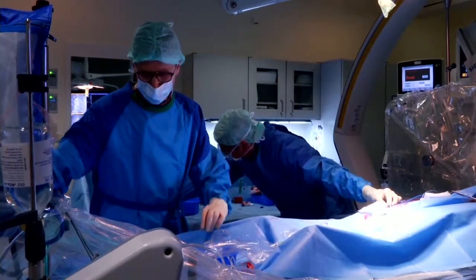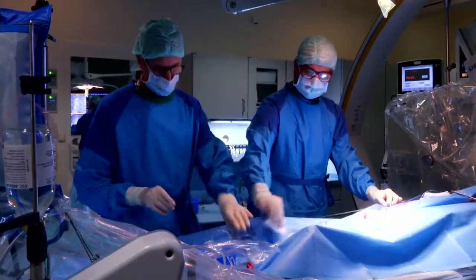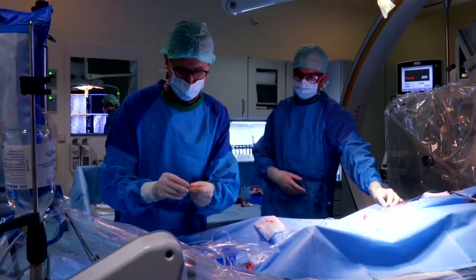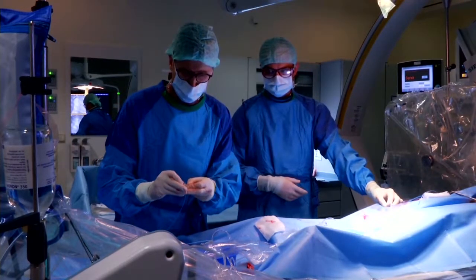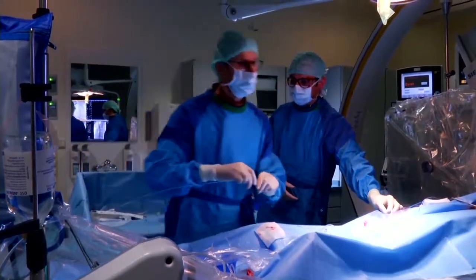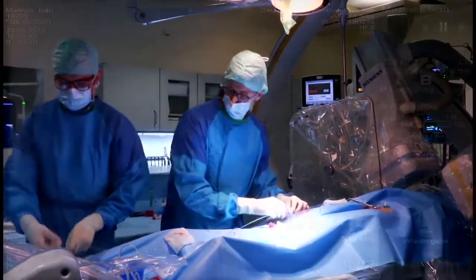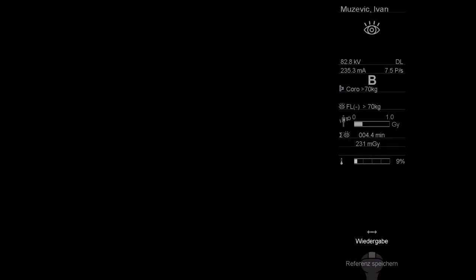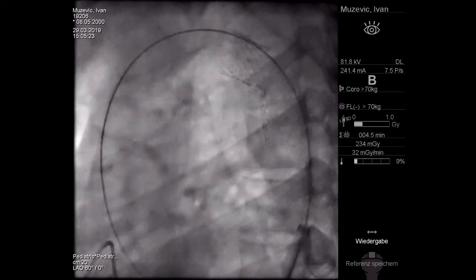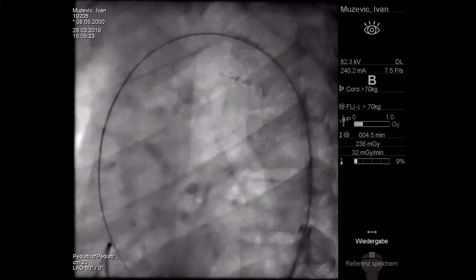To be honest, I'm not very fond of redilating it at the moment because I feel that the stent we just placed has not much grip. It's a very soft tissue in which we put it. And with any manipulations, perhaps we are able to dislodge it. I'm a little bit afraid that we perhaps push it forward over the carotid artery, and I would like to avoid this and perhaps come back later. So now, hopefully we do not get entangled here.